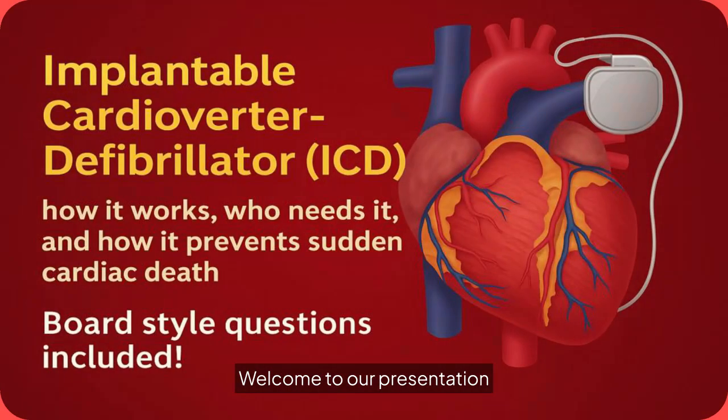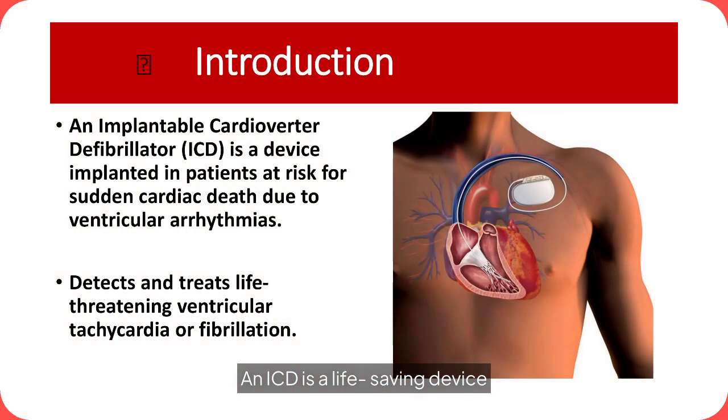Welcome to our presentation on Implantable Cardioverter Defibrillators, or ICDs, for educational purposes. An ICD is a life-saving device for patients at risk of sudden cardiac death due to ventricular arrhythmias. It detects and treats life-threatening conditions like ventricular tachycardia or fibrillation, ensuring patient safety.